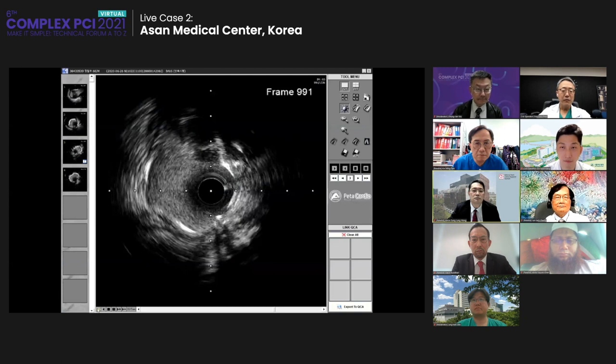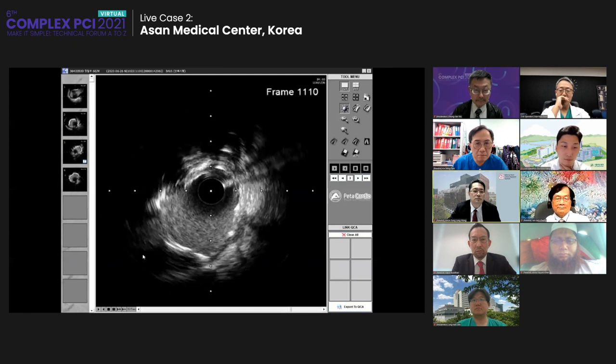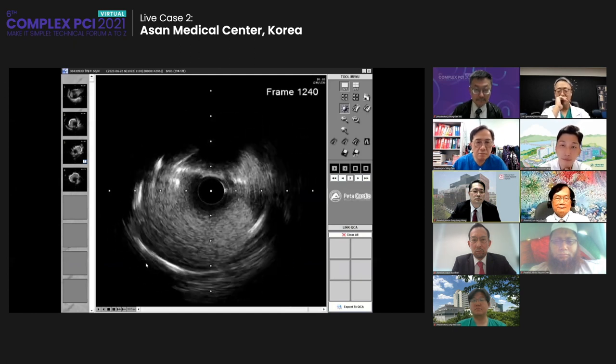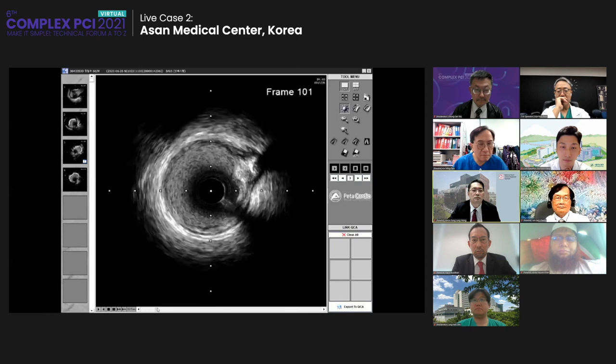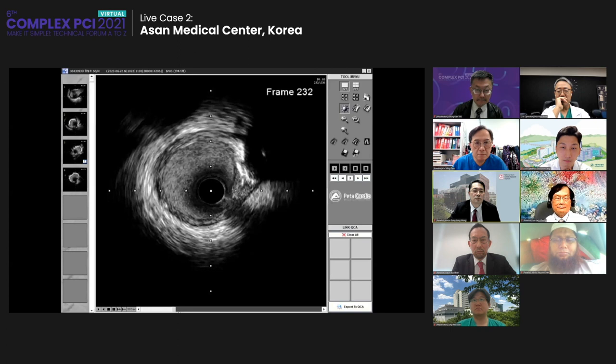Yeah. All right, so you just mentioned the calcium. However, the effective lumen is clear, it's quite big enough. And you just mentioned the calcific plaque outside of the stent. Yes. Anyway, the stent area is effectively dilated.